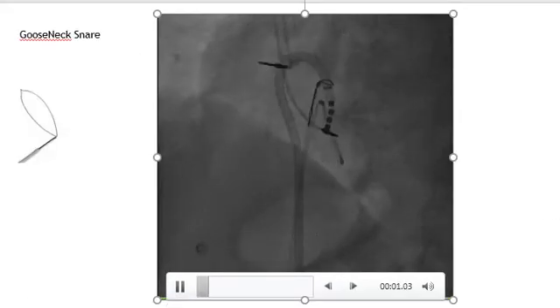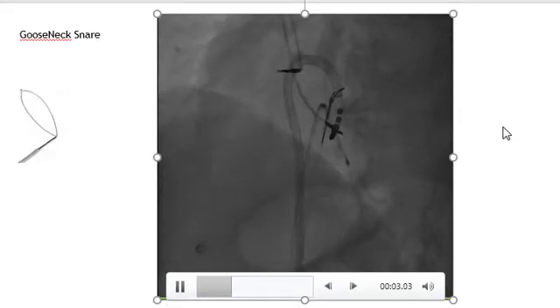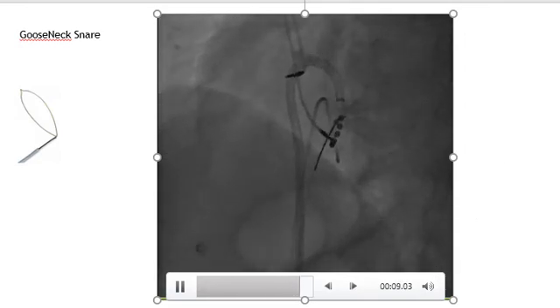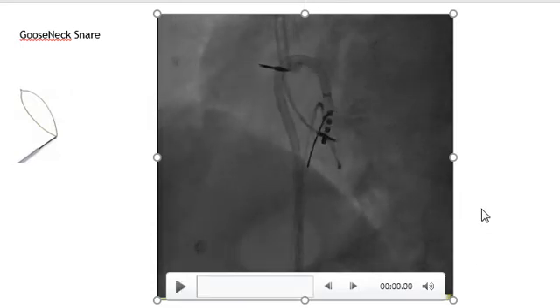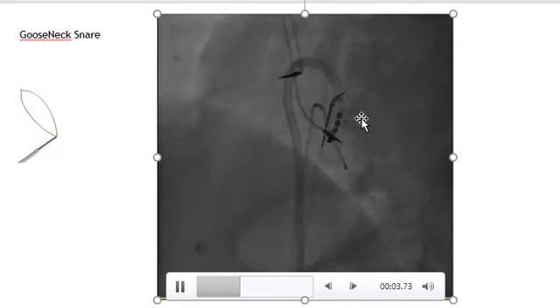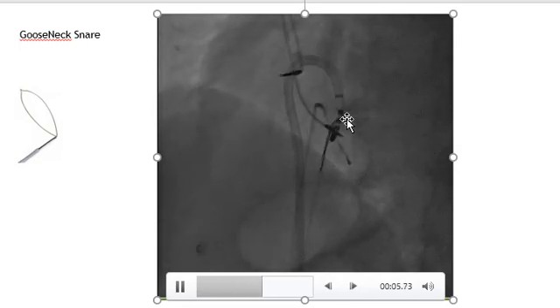The ablation catheter was snared by a regular gooseneck snare, and the pacemaker leads were made free from the right atrium and ventricle and extracted to the IVC. You can see how we snare the Agilist sheath and the ablation catheter.